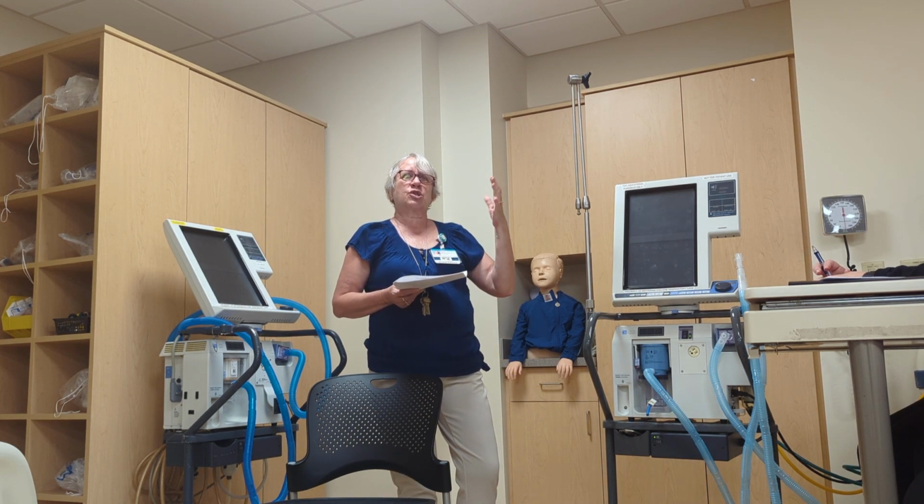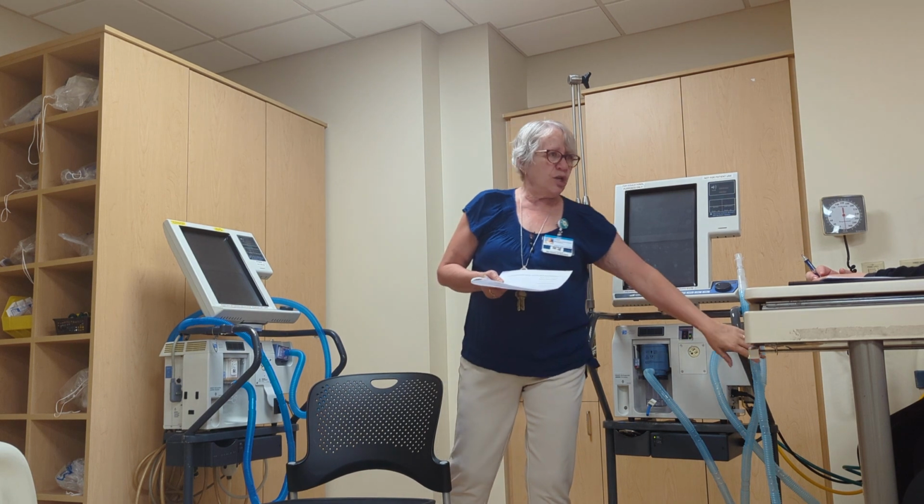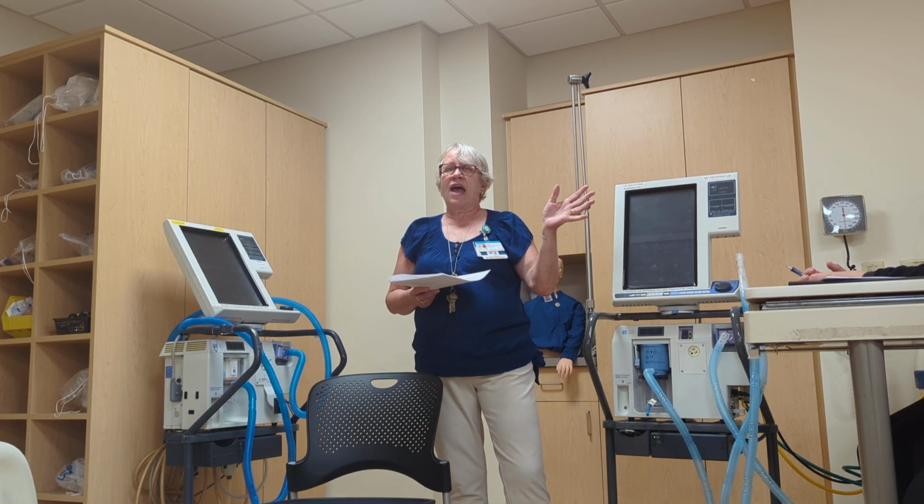And like I said, it makes sure it's working properly, and it makes sure that the ventilator calibrates to its tubing and its humidifier source. So this would be an HME. We would put an HME on there so that your numbers come back correctly. Okay, that's an SST.